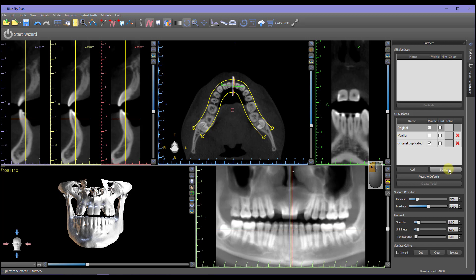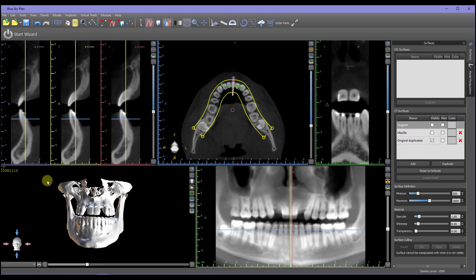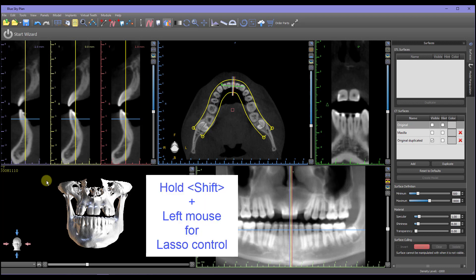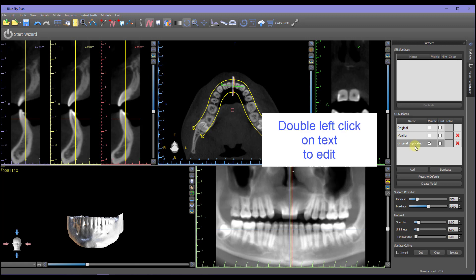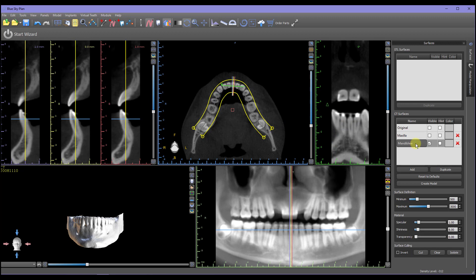With Original highlighted, click the Duplicate button. Uncheck the Original visibility, move the cursor over to the 3D view, hold the keyboard Shift key, hold the left mouse button down, and drag the lasso carefully around to isolate the maxilla, and release the left mouse button, cutting out the maxilla. Double-click on Original Duplicated and key in Mandible. Click Enter in order to save.